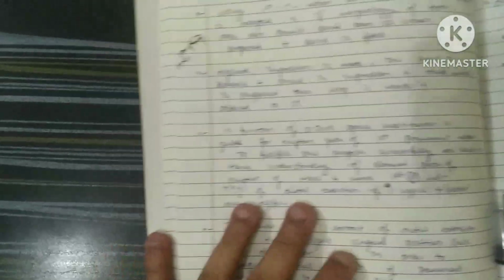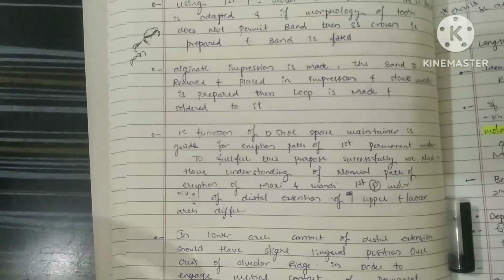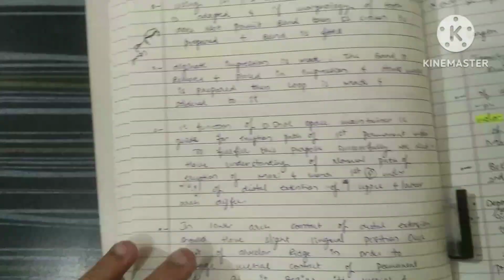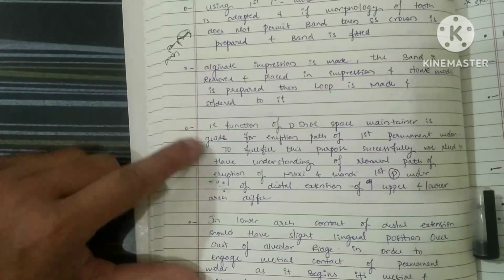Okay, henceforth now we are going to get that band. Now what is the next preparation? Distal preparation and the gingival extension, right? Now the primary function of the distal shoe space maintainer is to guide the erupting path of the first permanent molar.